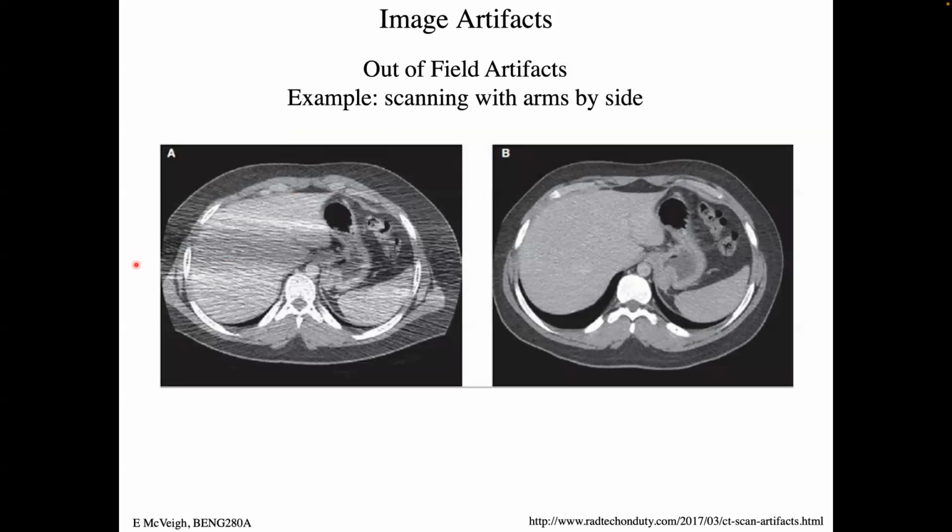And then when my detector's over here, the X-rays go through both arms. So now you have some very inconsistent data, right? Because things are coming and going onto the detector as you rotate the thing. And so that's not a good situation. So you lift the arms up and all of that goes away. All the data is consistent, right?